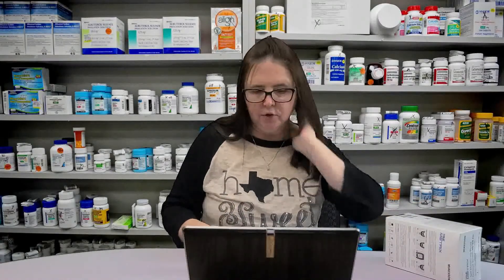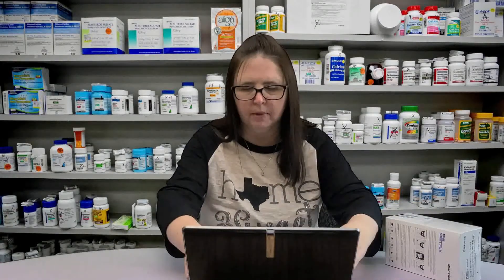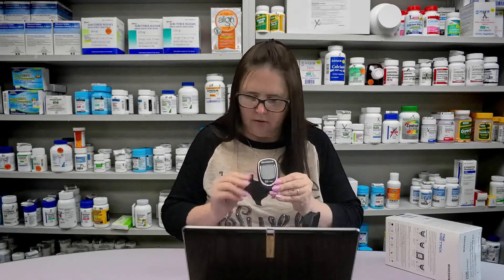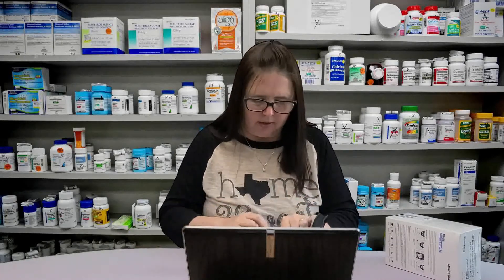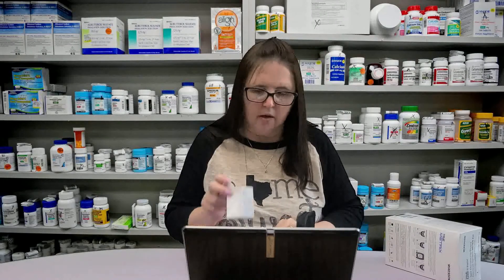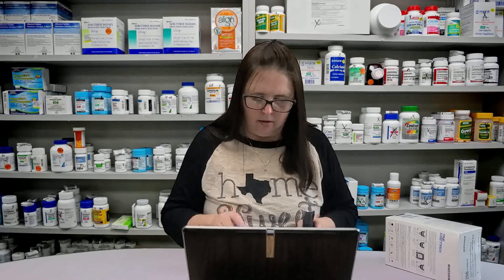So you've chosen the True Metrics glucose meter system. It includes the meter, ten test strips, a lancet device, and ten lancets. These all expire on October 31st of 2021. It also includes an owner's manual, a carrying case, and a logbook to document all of your test results, so that if you need to take it to the doctor's office you've got it all together.